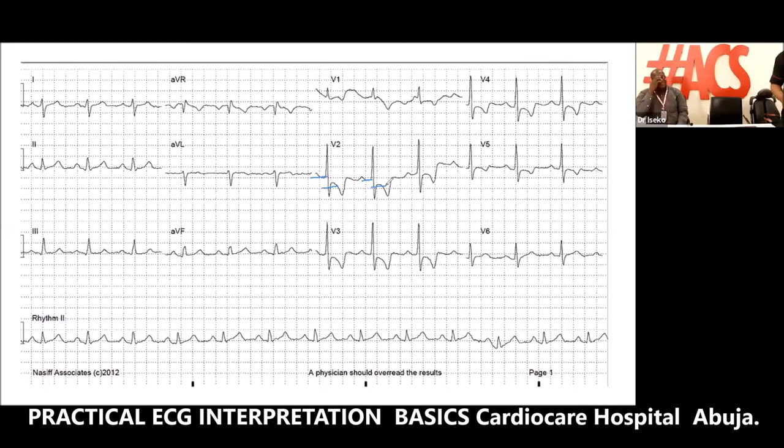We didn't talk about RVH and LVH at all. So you talk about RVH and LVH. When you get the slide, you look at it. In the right ventricle, just look at V1. If V1 is positive, if the R wave in V1 is positive, bam, right ventricular hypertrophy.